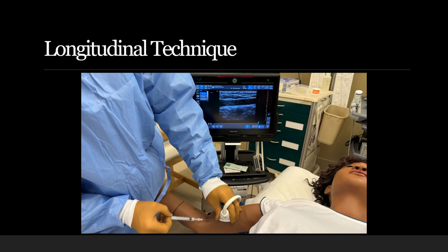So the other technique you can use for passing your needle in comparison to the transverse technique is the longitudinal technique. So I've got my operator here in the sim lab, and notice the probe now has gone from that transverse orientation of the probe marker to the patient's right. It's now rotated 90 degrees, and the probe orientation marker is up towards the patient's head. Needle shaft is still in the same position, 45 degrees. That will give us a nice hyperechoic linear structure. We'll see in a little bit. It'll travel down to that longitudinal vascular structure there. Sometimes you'll see some little lines below it called reverberation artifact.